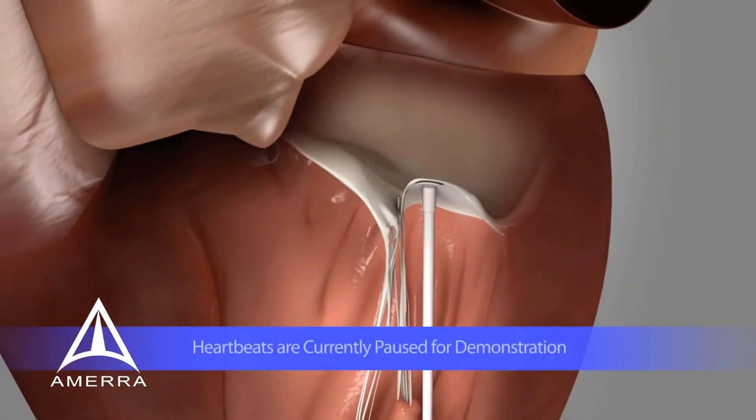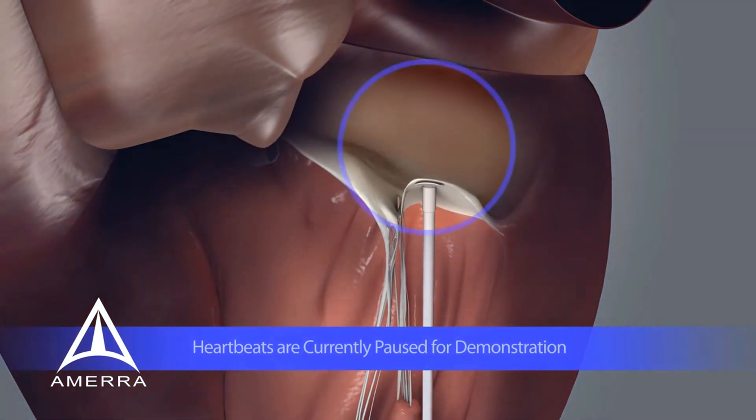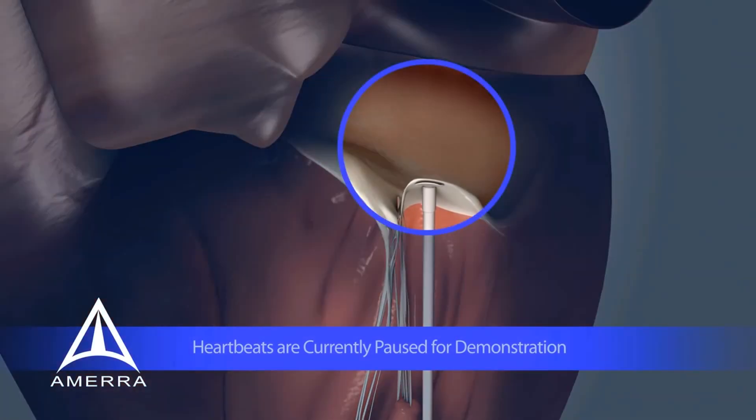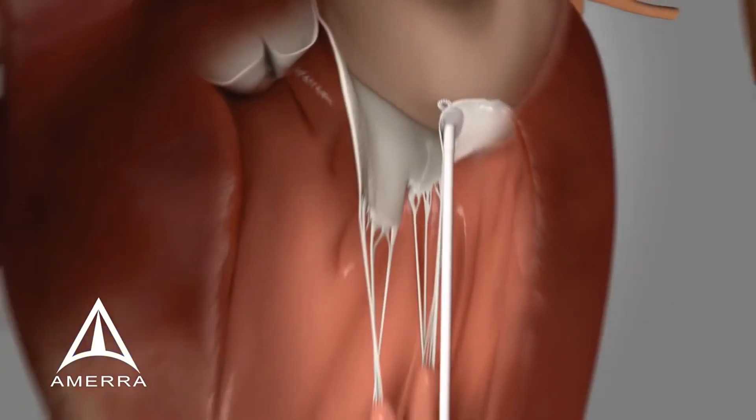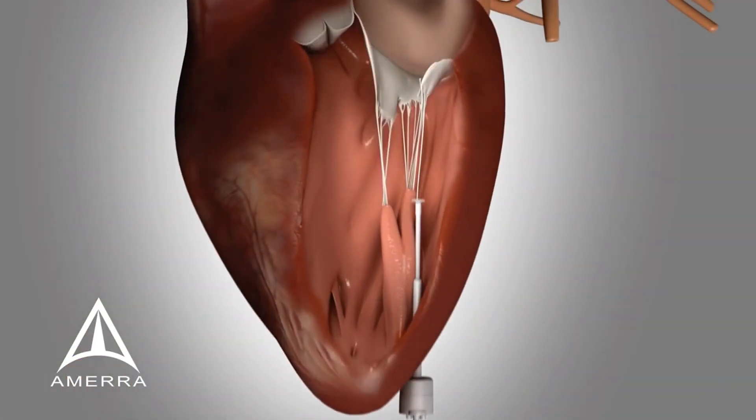When the proper positioning is confirmed with echocardiography, the operator activates the Harpoon device by depressing the plunger. A needle tightly wrapped with a preformed EPTFE bulky knot is rapidly advanced through the leaflet and withdrawn in less than one second. The bulky knot is deployed on the atrial surface of the targeted mitral valve leaflet.